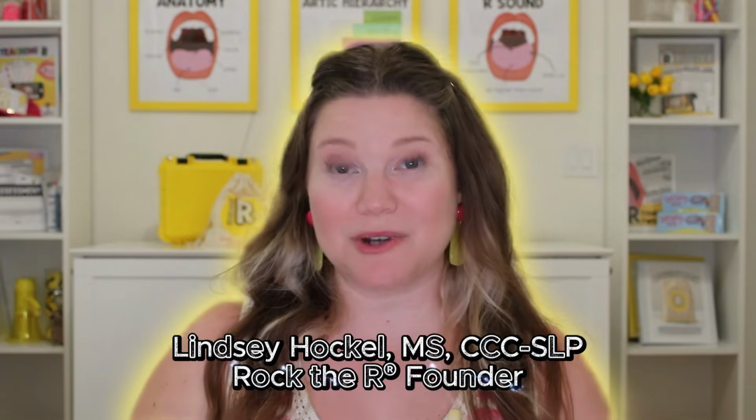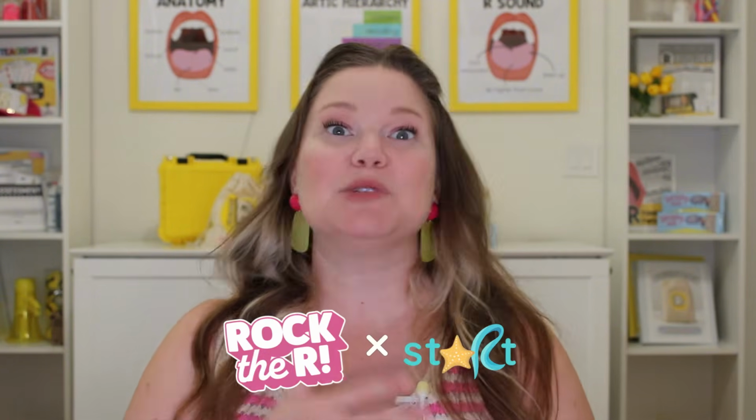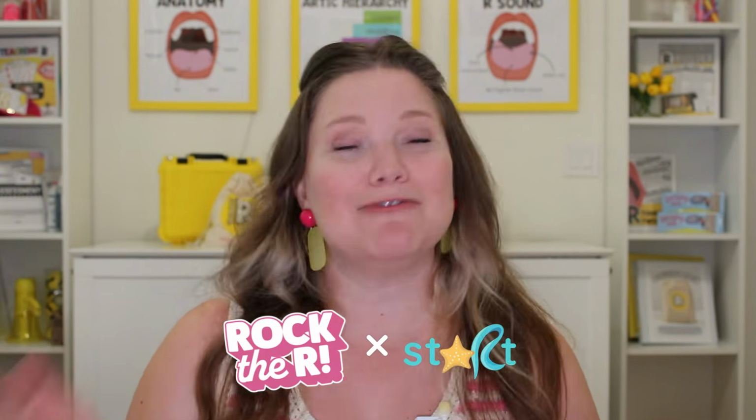Still here? Excellent. I'm Lindsey Hockel, SLP and founder of Rock the R, and I've teamed up with the awesome team behind the staRt app to bring you this tutorial series so that everybody can learn how to use this app. This is video 2 of the series, and we're going to talk about how to download and set up the app. Let's do this.